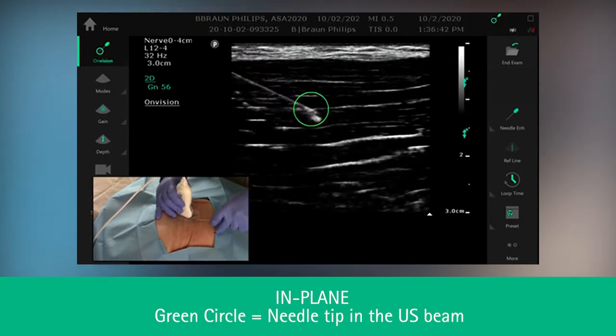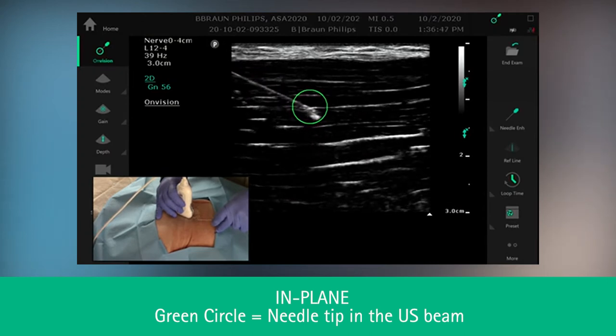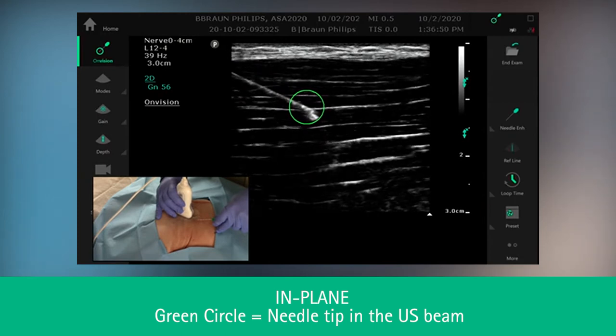At this point, you can see the green circle. The green circle identifies the needle tip. You can clearly see the needle shaft as well.